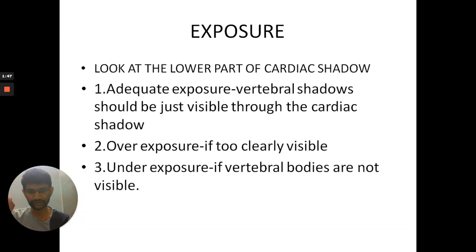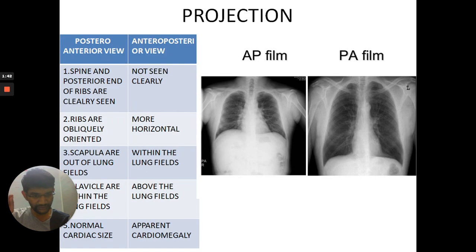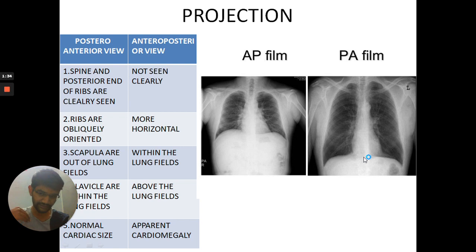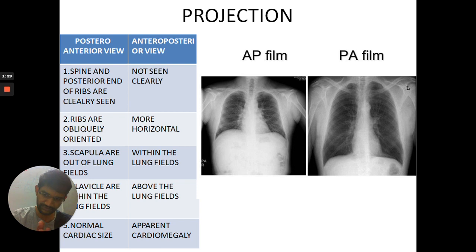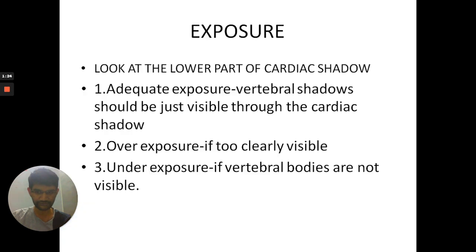Next comes exposure. To check whether the X-ray is adequately exposed, look at the lower part of the cardiac shadow. If the vertebral bodies are very clearly visible through the cardiac shadow, then it is overexposed.